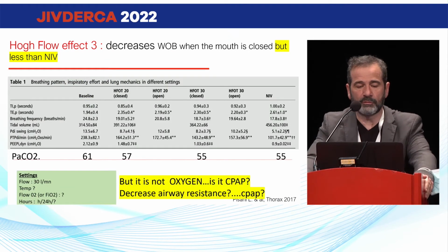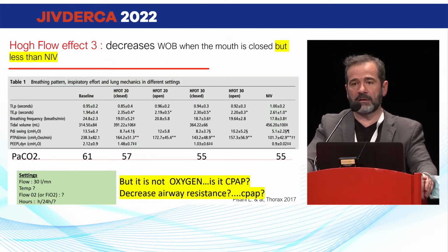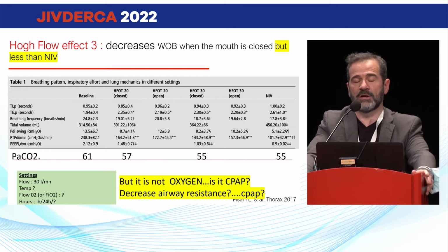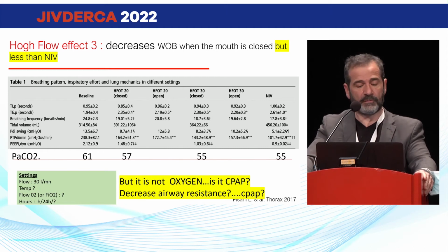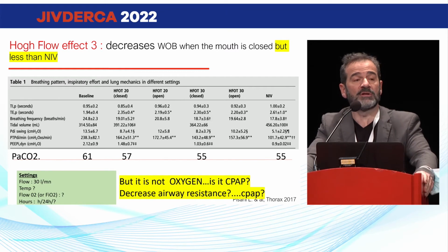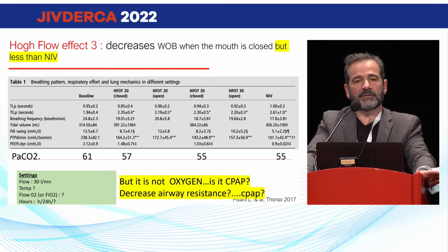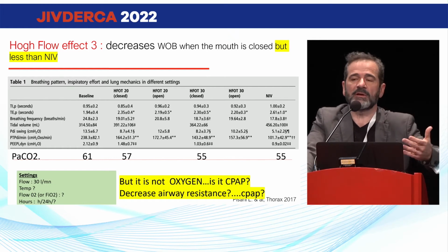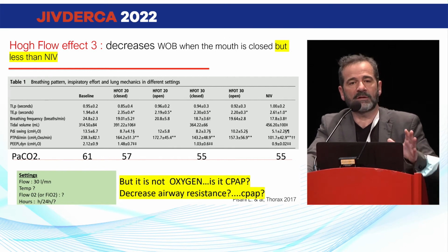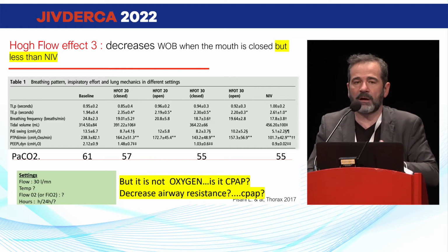And let's go to the chronic and physiologic effect. And again, probably the most important study in physiology in chronic patients, this work of Lara Pisani, shows that you decrease work of breathing. Okay, I agree with that. For me, these studies, I am making a critique, but these studies are always right. I'm just showing you that the truth is not perhaps what is concluded, but the results are always good.